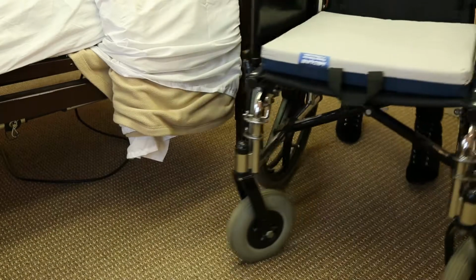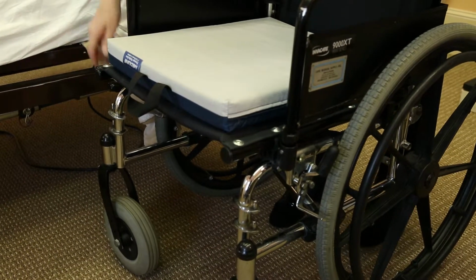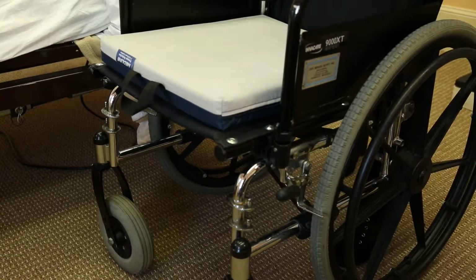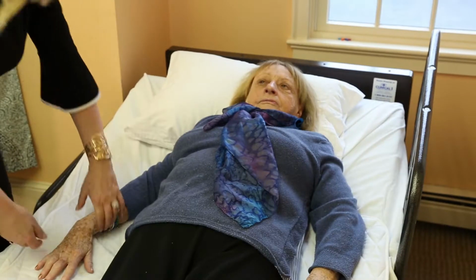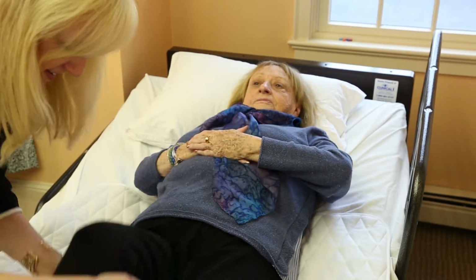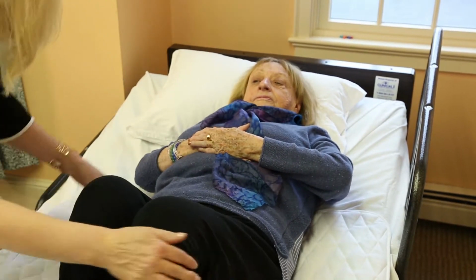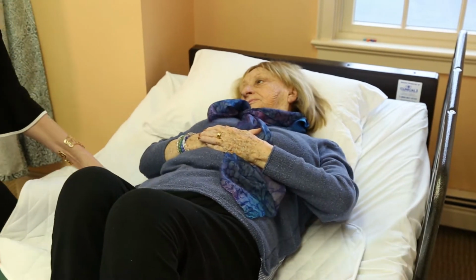The wheelchair should be set up at the end of the bed and it's really important that the locks are on. Then please make sure that you have a chuck or a draw sheet under the patient. Then you are going to bend both knees and have the patient cross her arms over her chest. You're going to pull the draw sheet and bring the patient nearer to you.